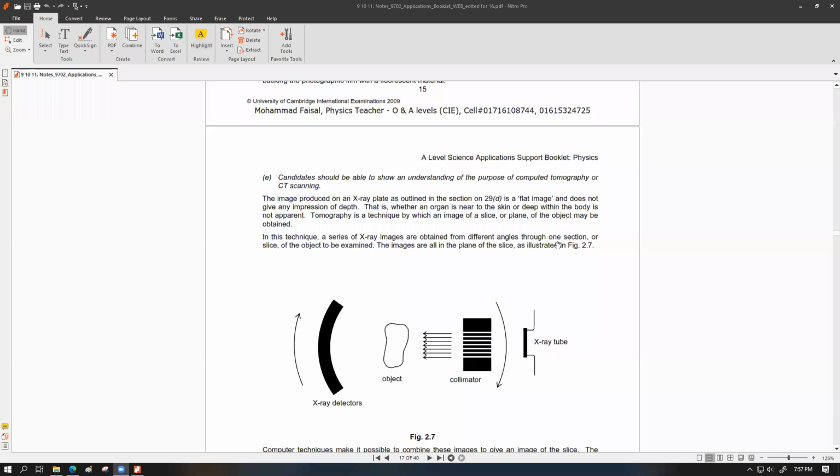So last class we saw how the X-ray works. One of the key primary things about X-ray is that it is a 2D scanning of a human body. 2D scanning means it scans one planar view of a certain object or a patient on a photographic plate. So you have length and width, you have a flat image from which you have to gather data.